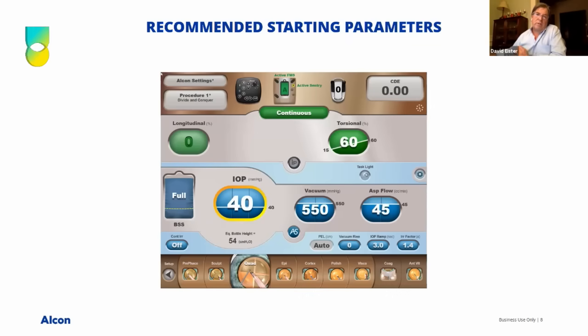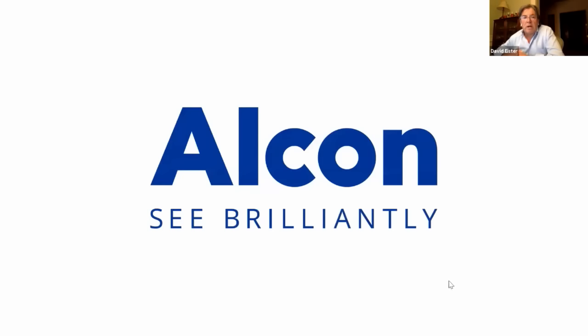And I wouldn't start there, certainly if you're learning. Start about 550 or 500 so you have good holding, and then your energy will be effective in terms of cutting the lens tissue. So anyway, I wanted to go very quickly here, and in part just cover a few things about the technology and the design. Hopefully this helps you a little bit in terms of understanding what we bring to surgery.